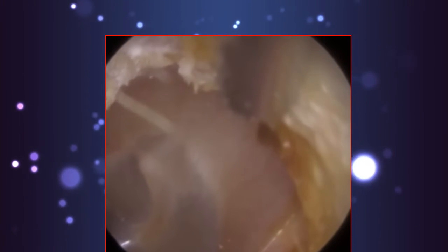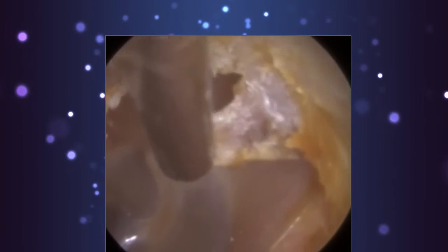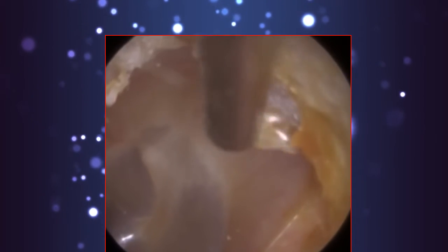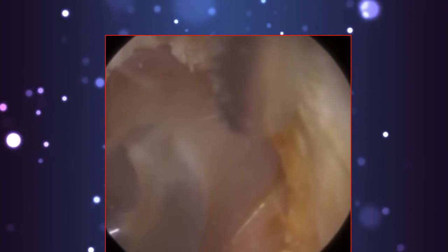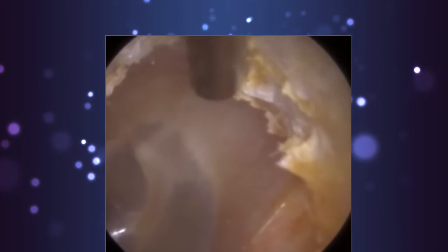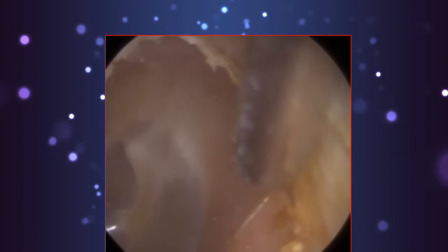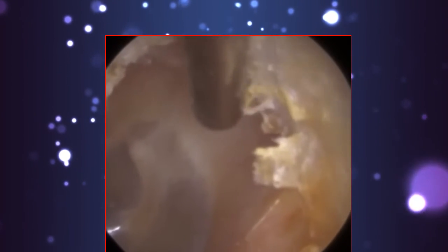So they're doing everything they can. However, patients are still coming out with chronic ear infections. They also use a bit of dry mopping. I know in America, dry mopping is used a lot. They give it a cotton wool, and you attach it to the end of a Jobson Horne or St Bart's ear hook. There's a serrated tip there, and you wrap the cotton wool around the serrated tip, then go into the ear and spin it.